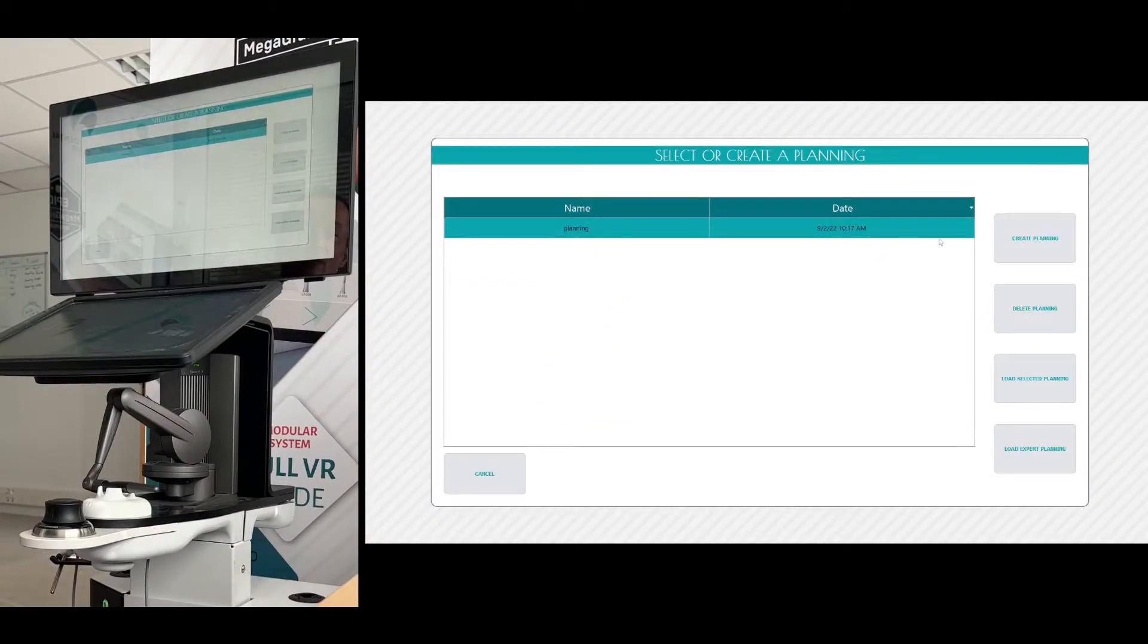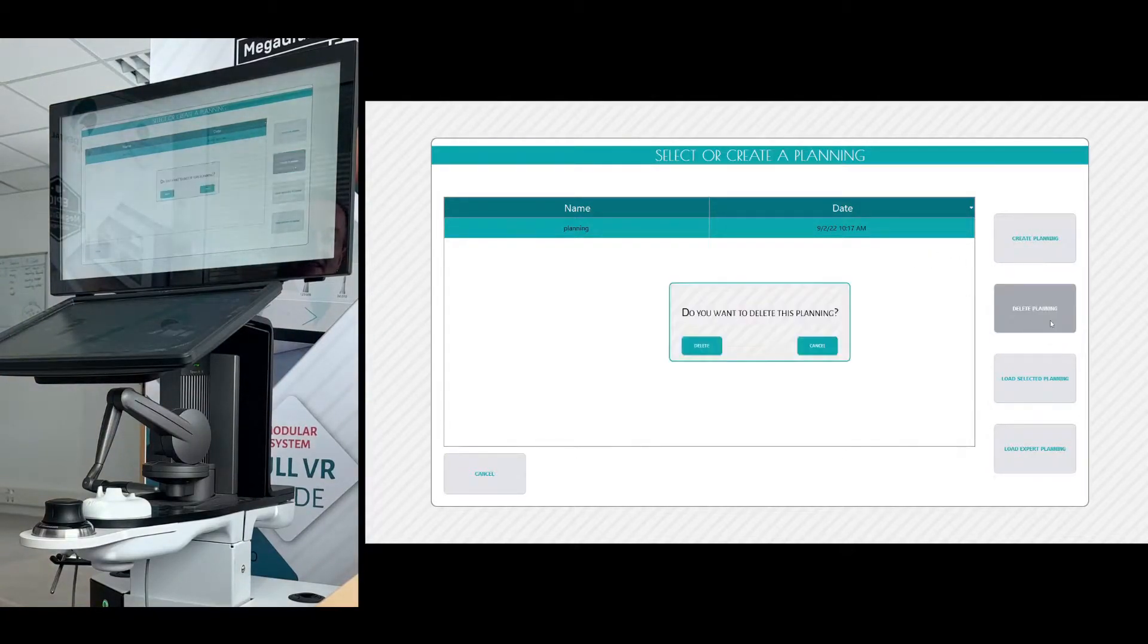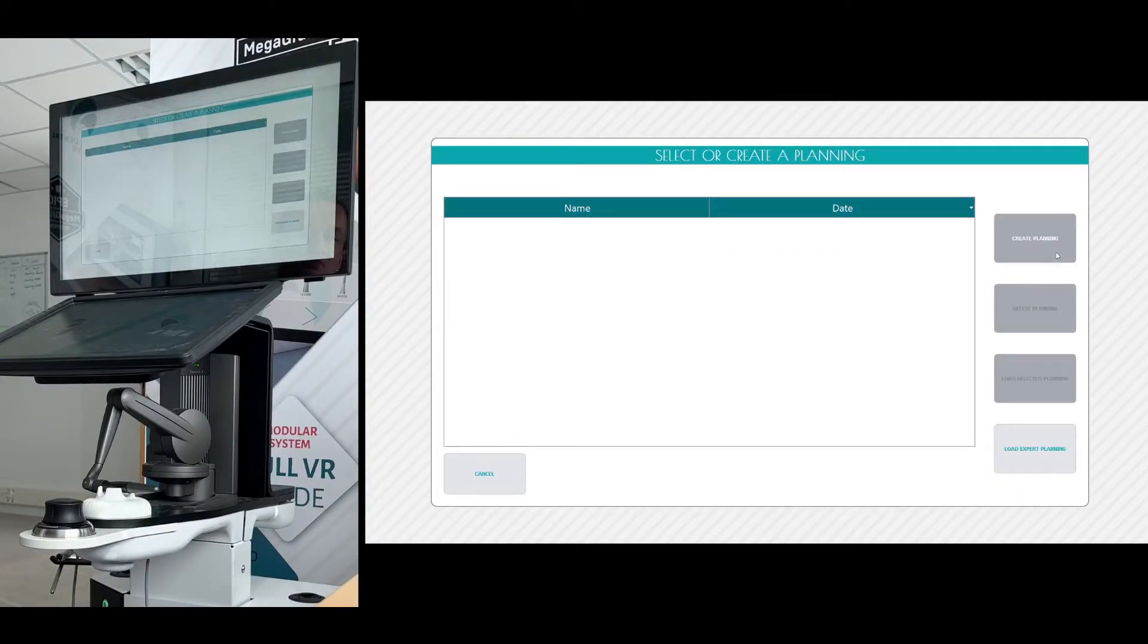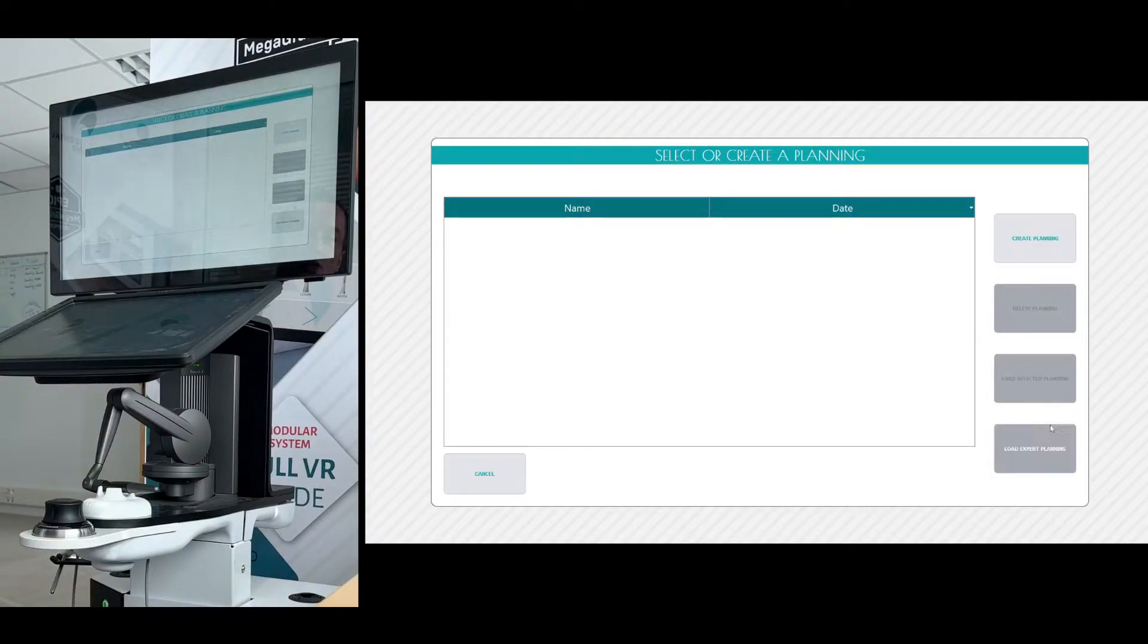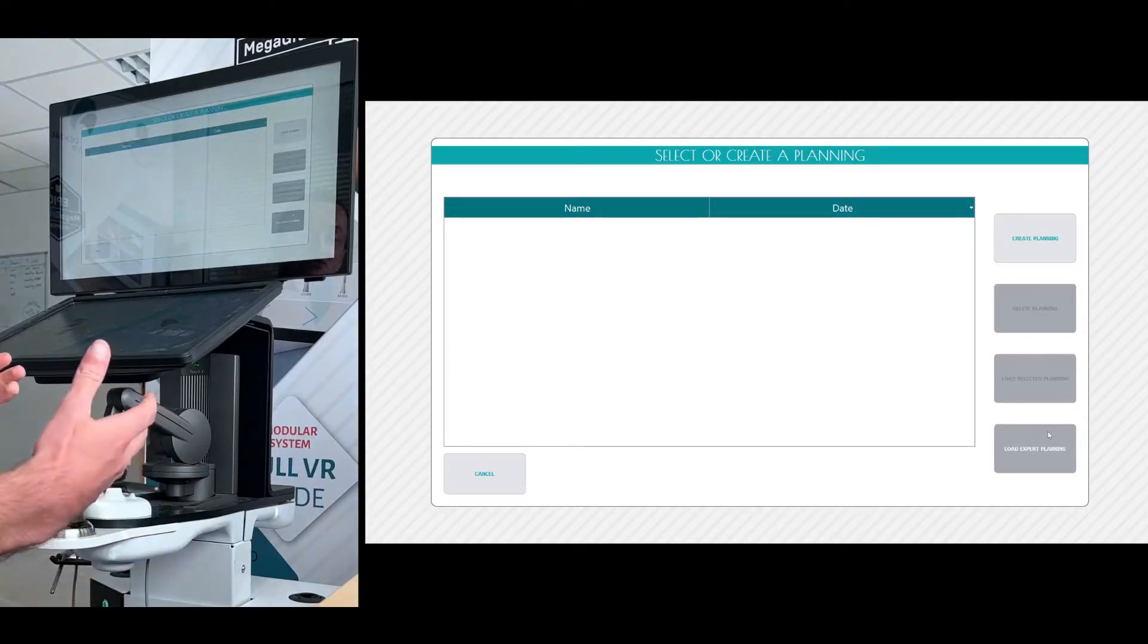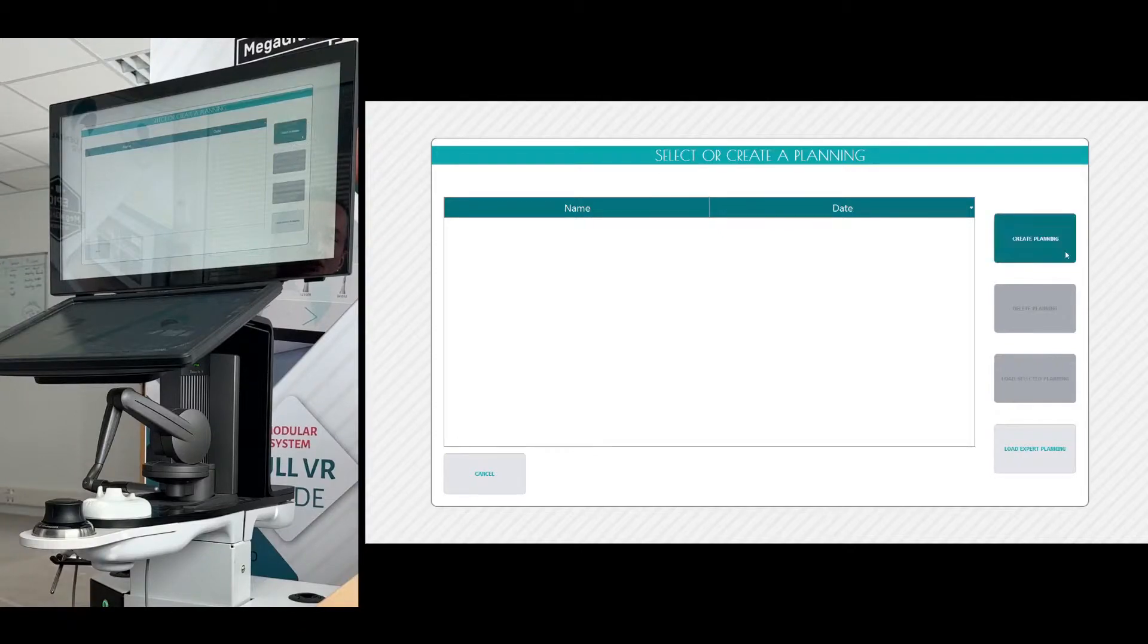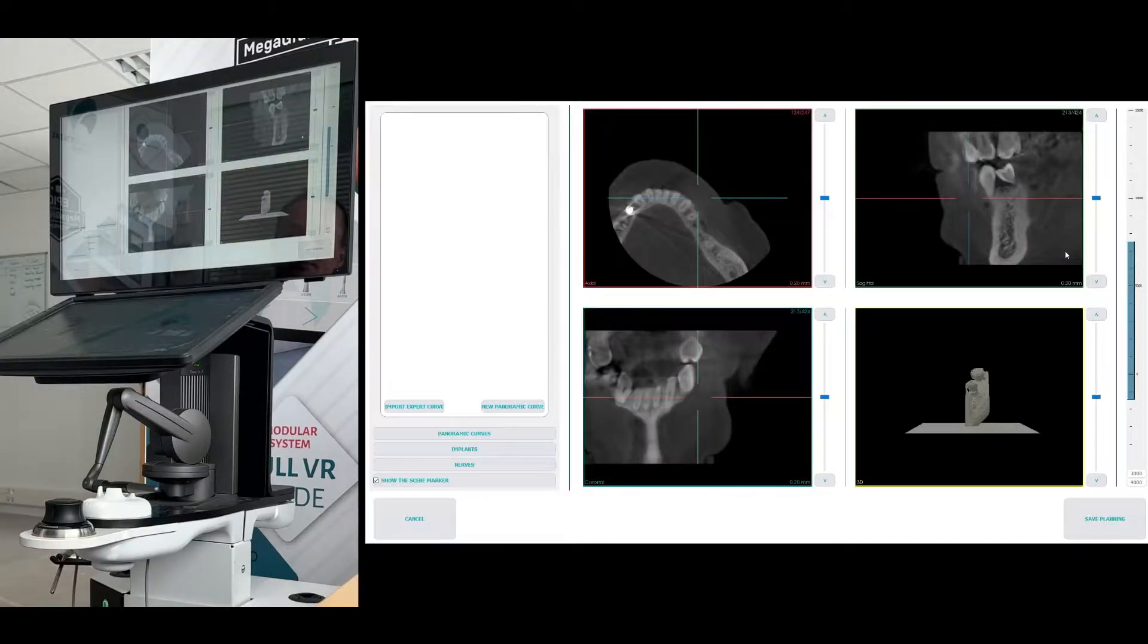And then we already have a planning that was created previously. So I'm just going to delete that one by clicking this button first. And you see at the moment, I have two options because there's no other plannings. So I can create a brand new one or load the expert planning. This is the person who created the exercise. So I'm going to go in and create my own planning by clicking the button at the top.